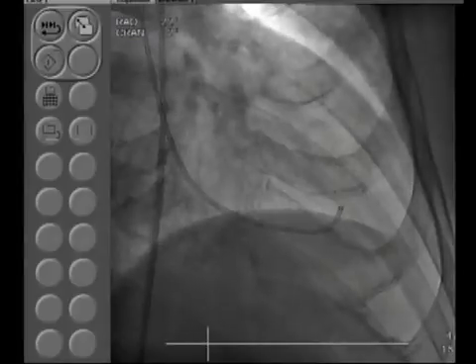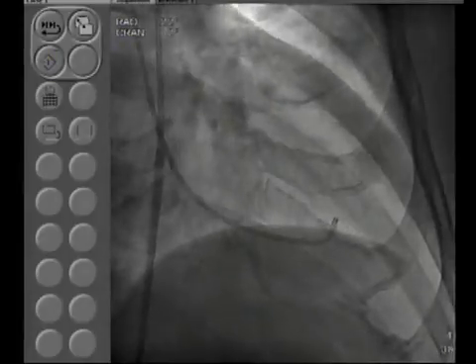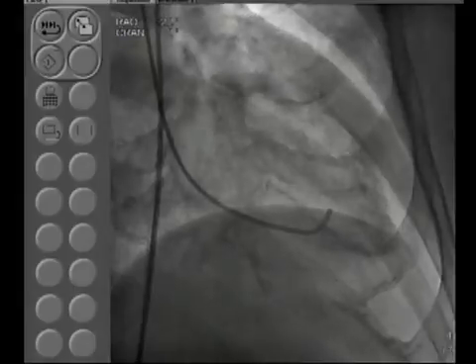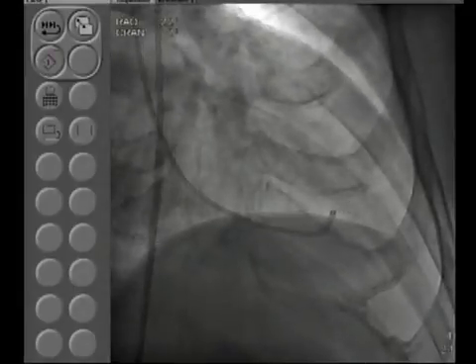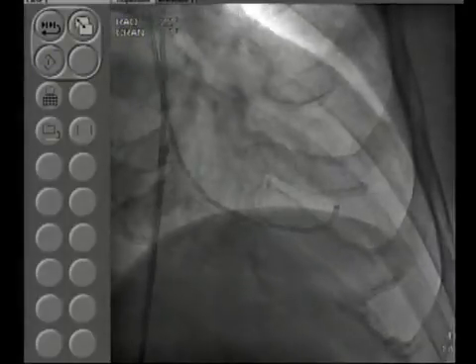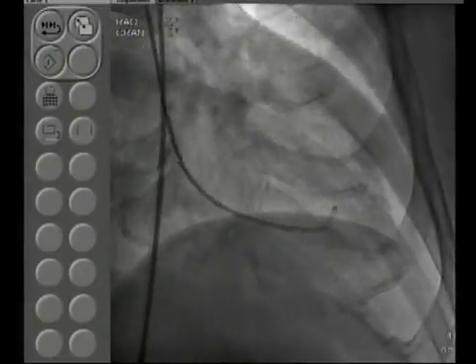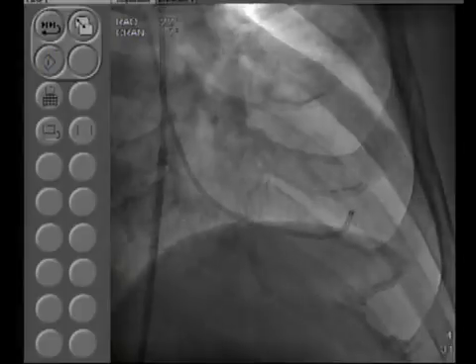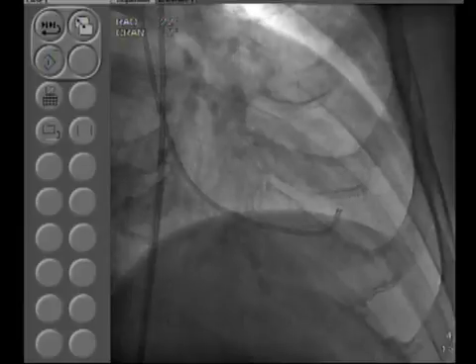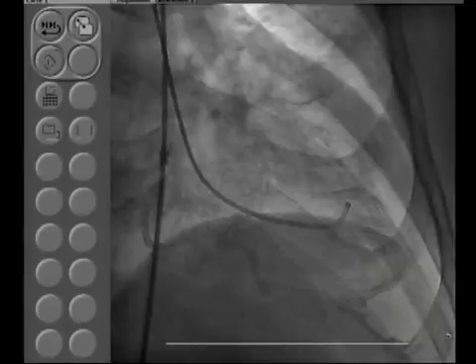And if you see here the way we do left ventriculogram, we have used a JR catheter, very easy to get into the left ventricle. Do your left ventricular end diastolic pressure. That will give you an idea, especially if the patient has renal insufficiency, how much hydration you need to give the patient. Knowing that his EDP was normal to below normal, then we can go ahead and hydrate. And with the same JR catheter, we were able to inject about 6 cc's of dye, and with hard injection, we were able to have an overview of his left ventricular function, which is normal.